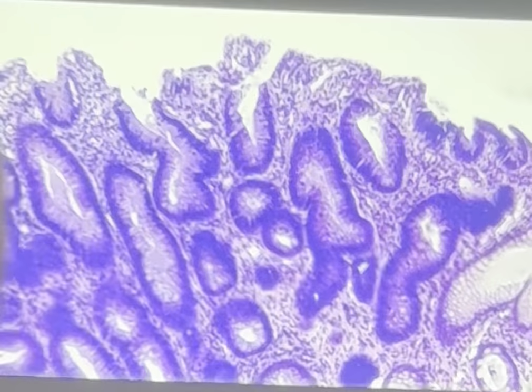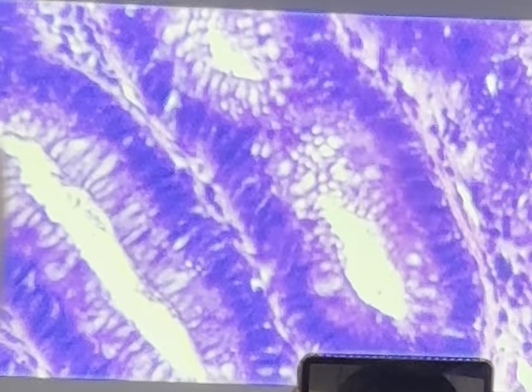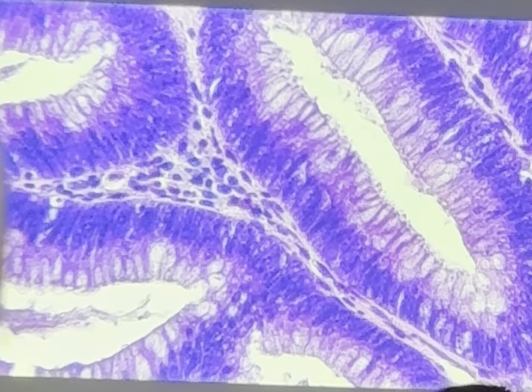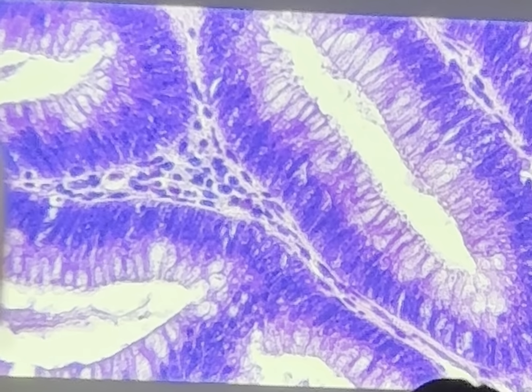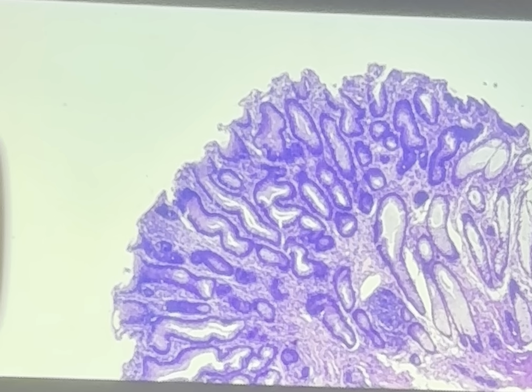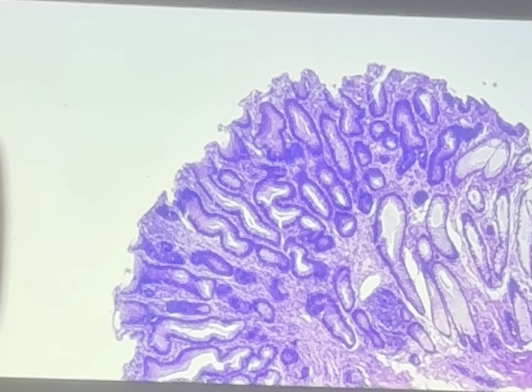So here's the colon. And here's the dysplasia. This one's better because now you can see it's more clean. The really elongated pencillate cells. They're really elongated. So that's another tubular adenoma. Sometimes instead of forming tubular, they can also form villous structure. That would be called a villous adenoma. And then sometimes you get a mix, so it would be called a tubulovillous adenoma.